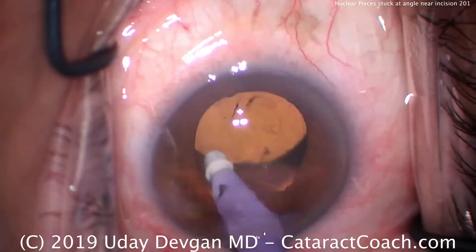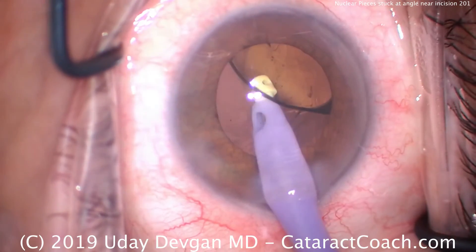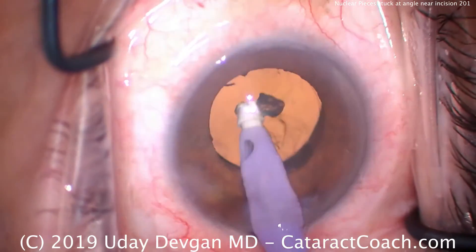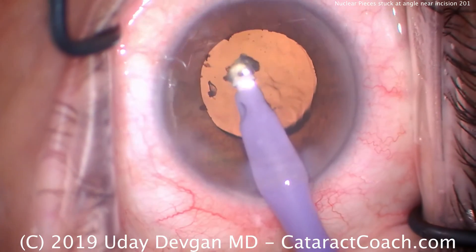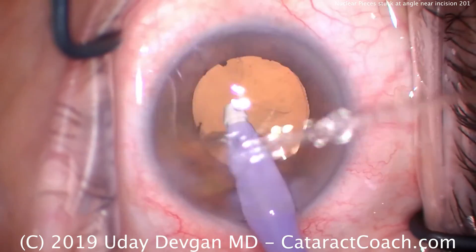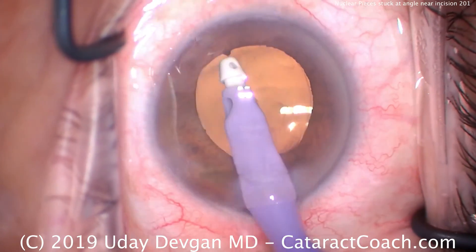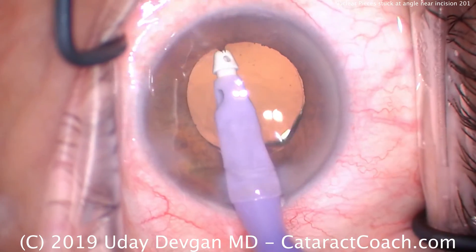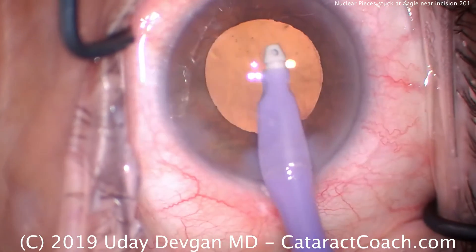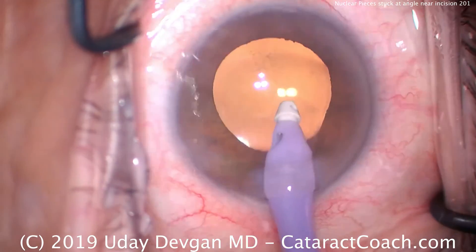Now the I/A probe can go in the eye. We'll go underneath the IOL to remove the viscoelastic. And there's that little piece of nucleus — you see it flying around, right there at the tip — we can just aspirate that down. Removing all the viscoelastic. There's a little bit of loose iris pigment there; we can just aspirate that out as well, being very gentle.